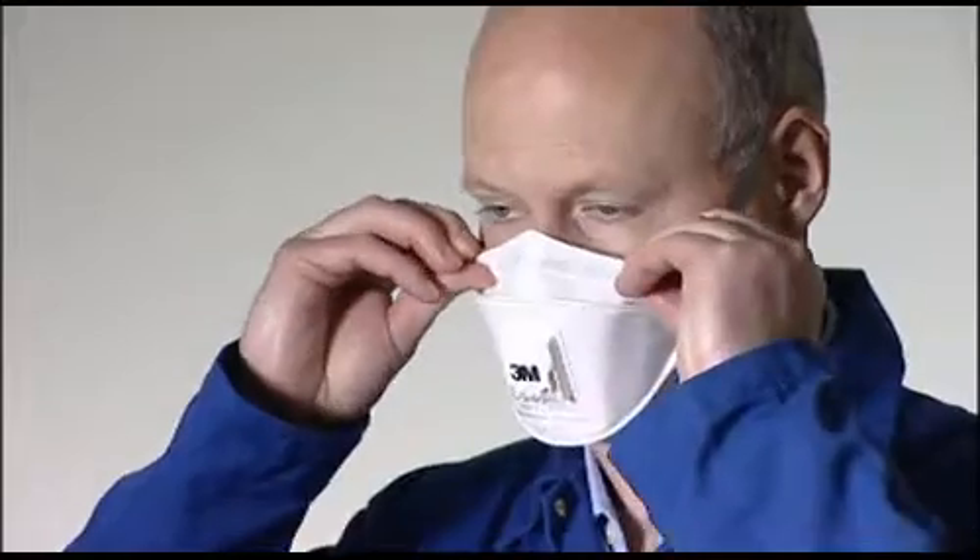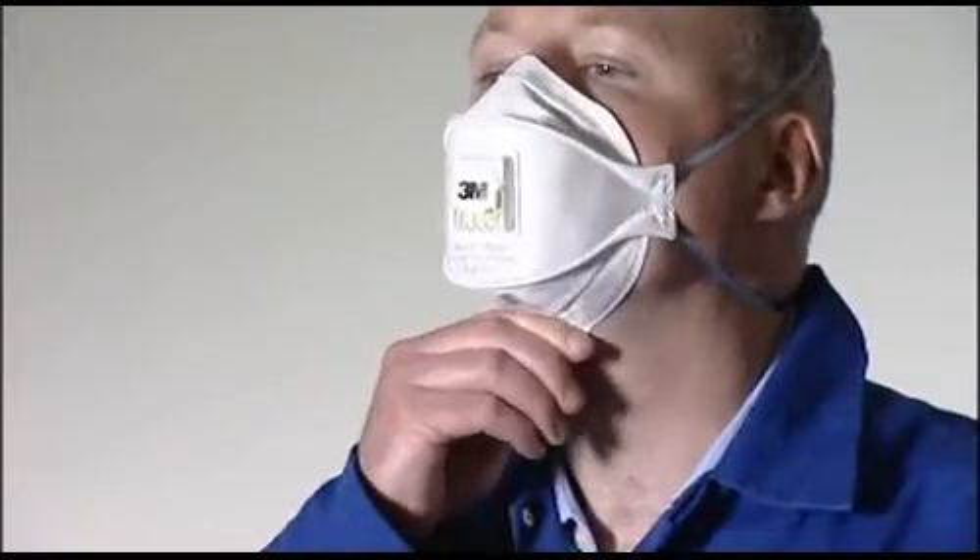The straps must not be twisted. Adjust the top and bottom panels for a comfortable fit, ensuring that the panels and tab are not folded in.